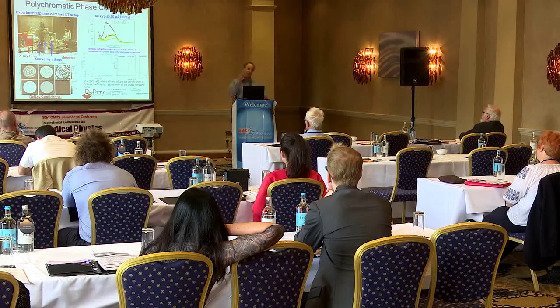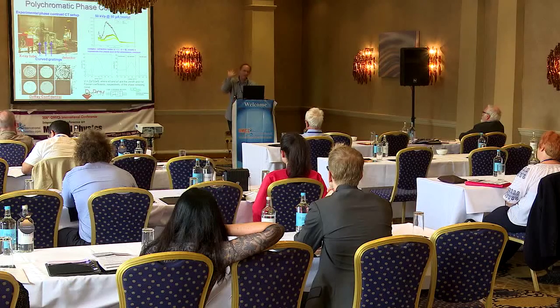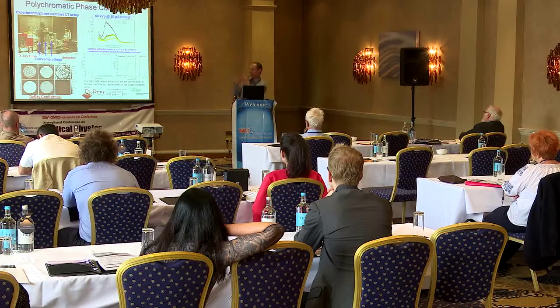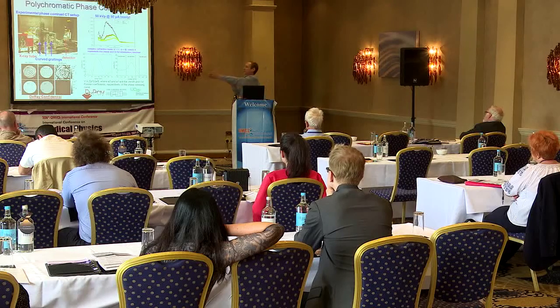So there's another application. This is probably a lot more exotic and a lot farther away from the clinic, but phase contrast CT has received a lot of attention in the last 10 years, and currently all of the phase contrast CT systems have to raster scan a pencil beam across the object, because the gratings that are used to set up the phase contrast conditions are a function of angle and energy, and without measuring the energy of each X-ray, you can only do it in line.